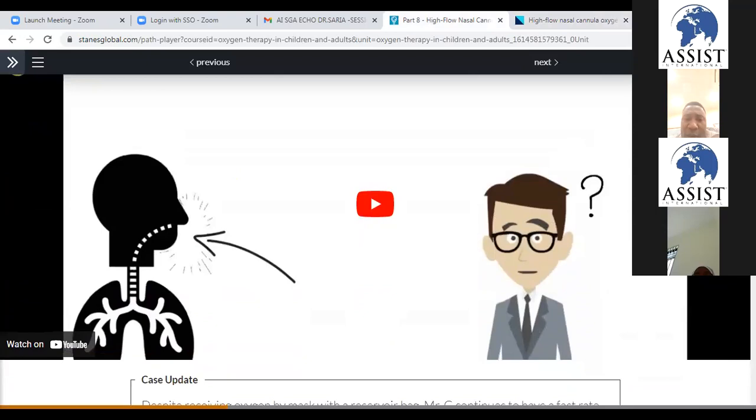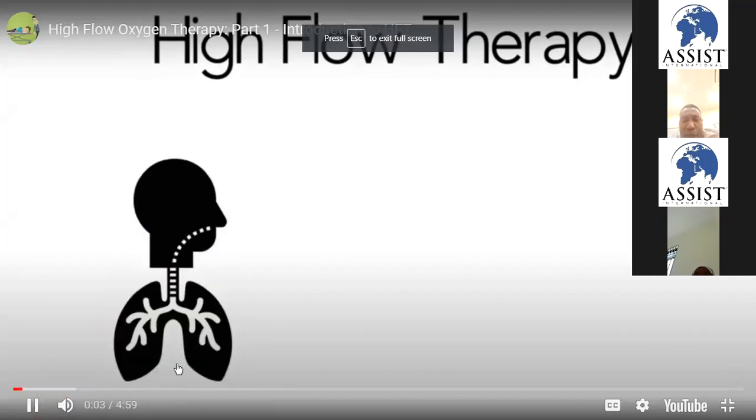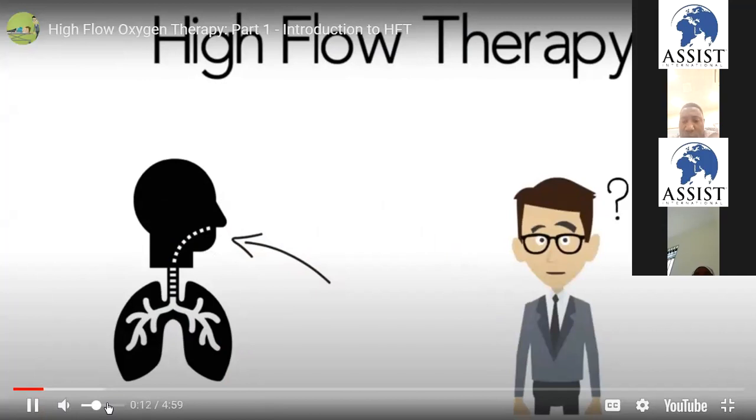Let's watch this video to learn more about high flow oxygen therapy. So what is high flow therapy? High flow therapy is when oxygen is being delivered to the patient at a flow rate that meets or exceeds their inspiratory flow demand. What does that mean?